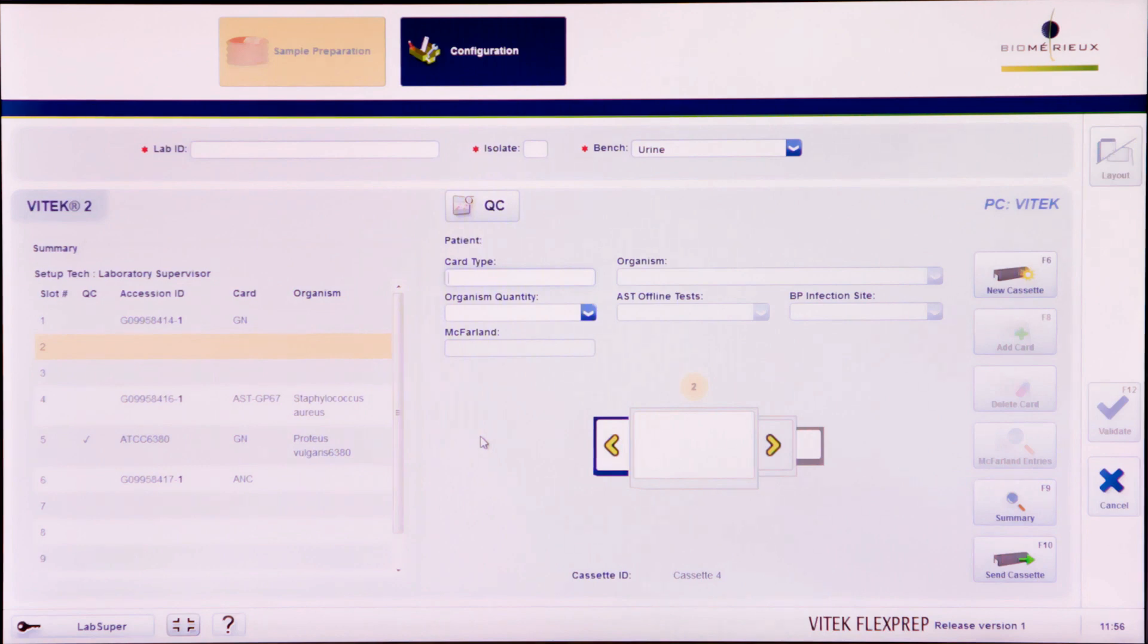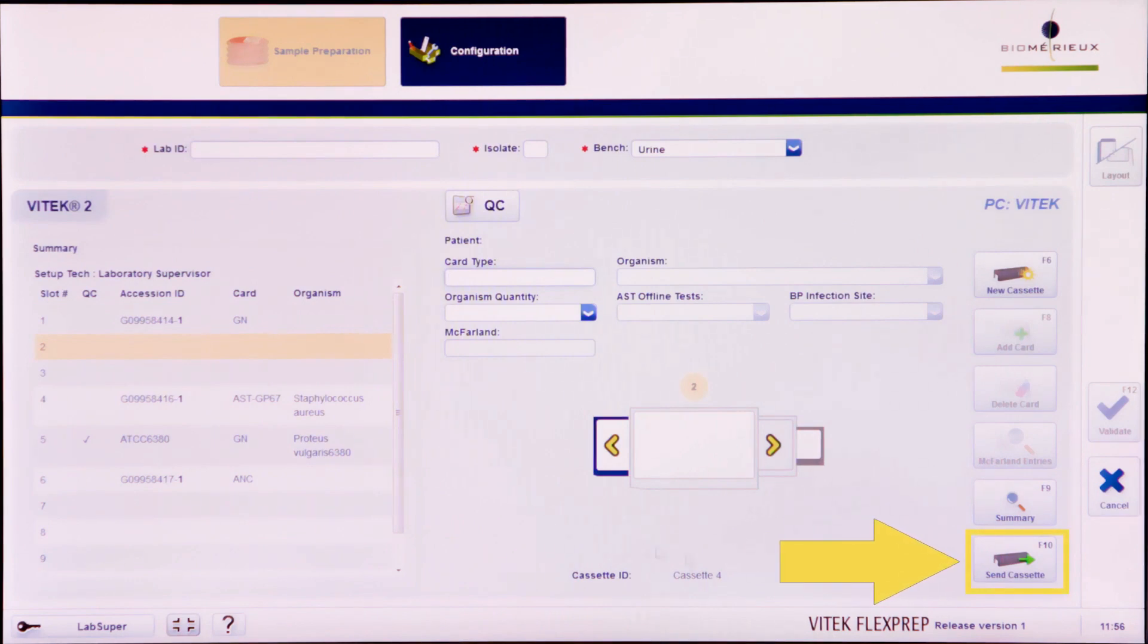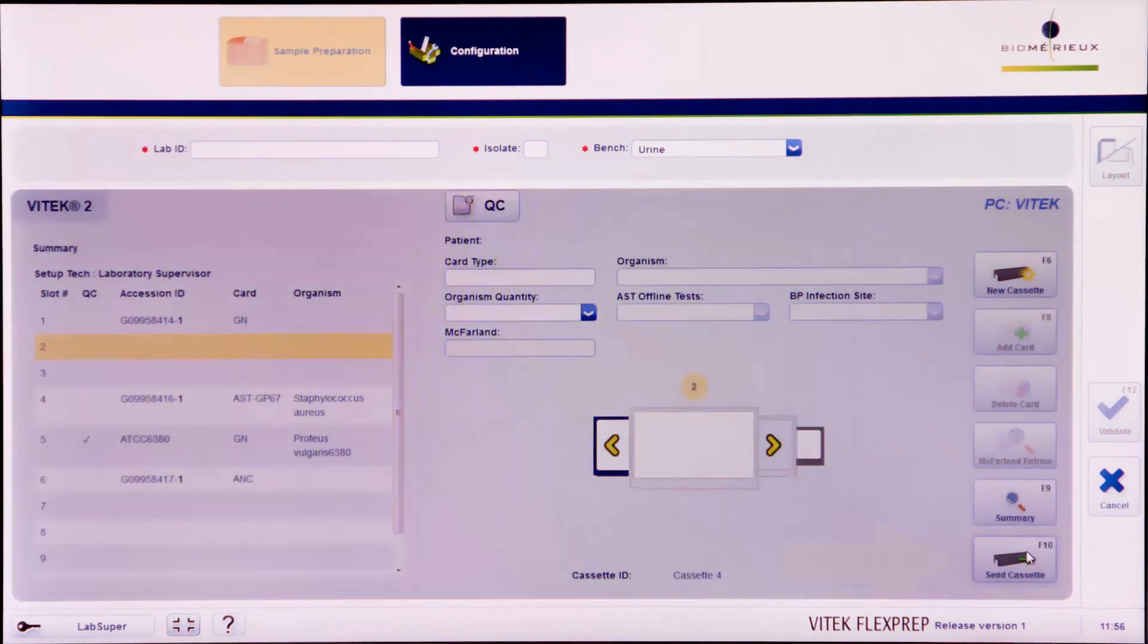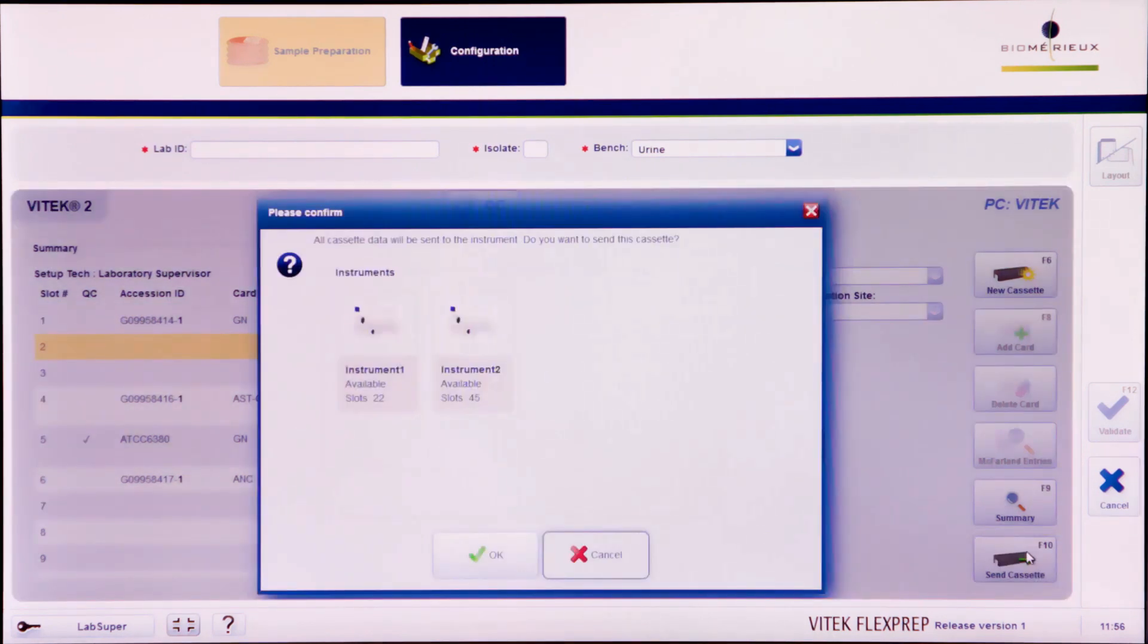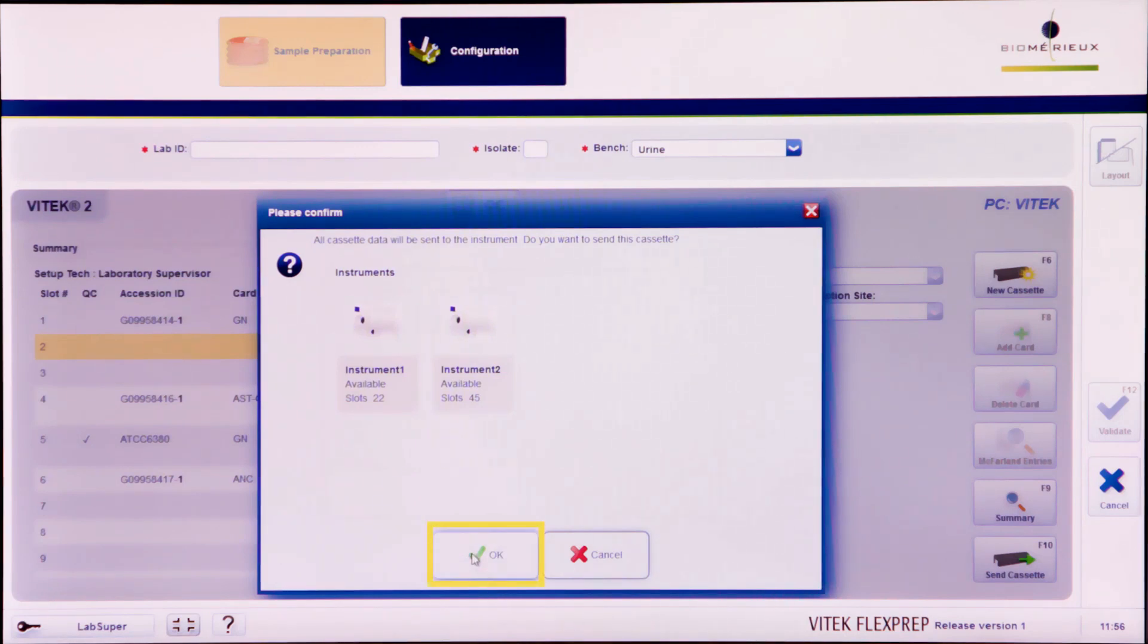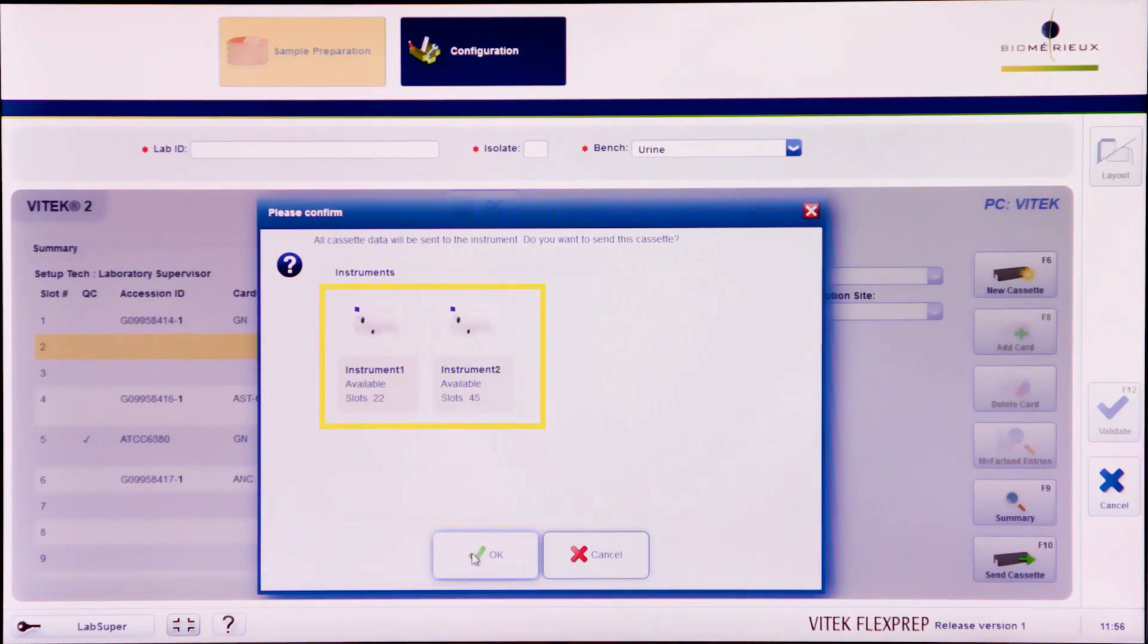Upon completion of a cassette, click the Send cassette icon or press F10 to send the cassette to the Vitek 2 PC. A confirmation dialog box will appear. Select OK to send the cassette. The definition will be sent to all of the listed instruments.